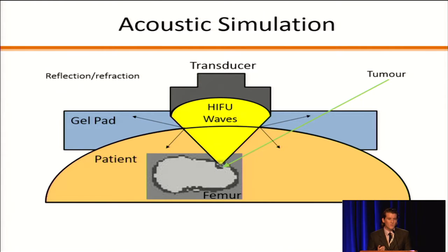Moving on to the acoustic simulation, again the Rayleigh integral calculates the acoustic propagation of the HIFU waves towards the tumor location, and it calculates both the reflection and refraction at each tissue interface until finally it calculates the velocity distribution at the tumor location on the segmented image.